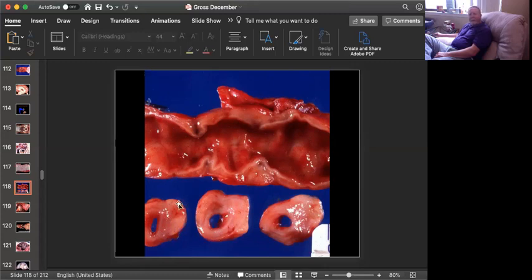This fibrosis extends transmurally through the wall into what looks like probably adjacent mesentery, or maybe just out into space. But it's a very irregular contour with a lot of fibrosis. When I see that in the gut of a dog, I'm not really thinking here about lymphoma. That could look like this, but it doesn't give you this sort of jaggedy appearance. There's a lot of fibrosis.